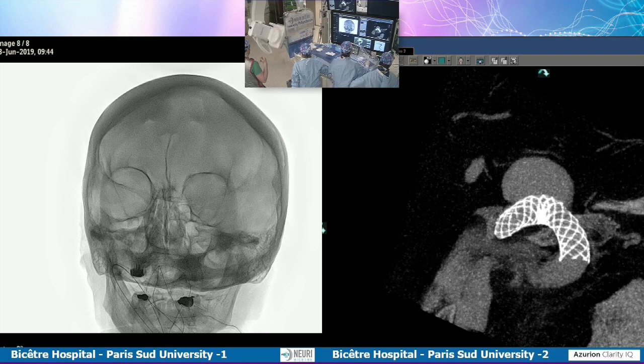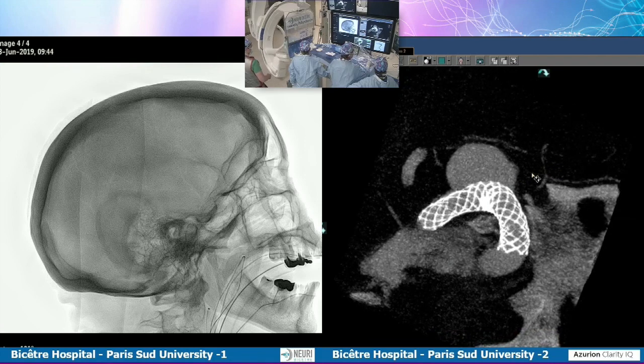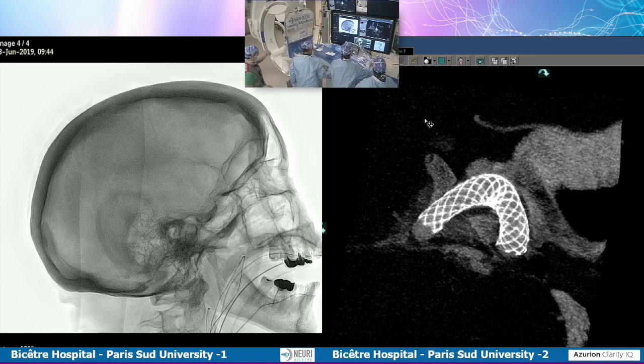Okay, so we are back to the set. We have to finish with this study, and Laurent is going to show the flow study and the result. Jacques, can you hear me? Yes. Okay? So this is the result of the VASO-CT.